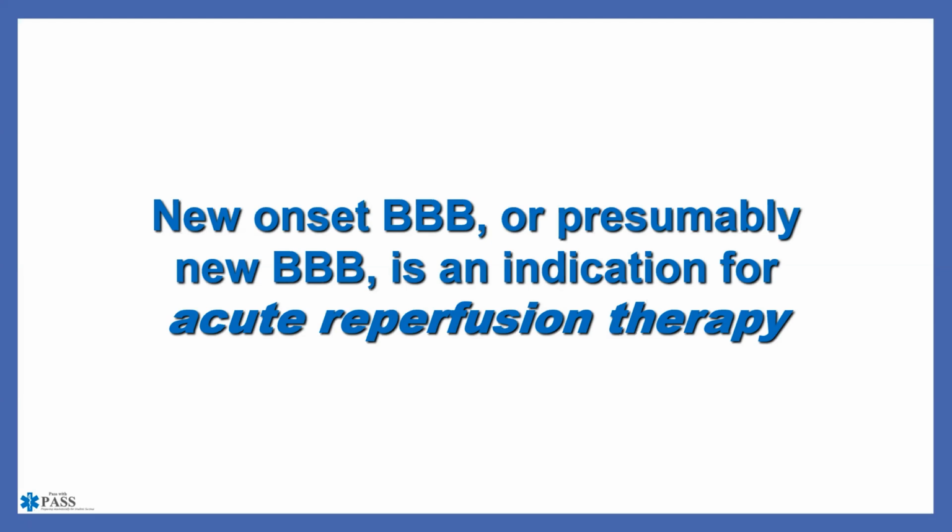Other than that, we take the patient in, we say, hey, we've got a patient that has a bundle branch block. The first thing that the doc is going to do is say, hey, can you call cardiology and see if they have an old EKG on file for this person? And if they get that EKG and they can compare them side by side and the patient had it before, probably not that big of a deal today.